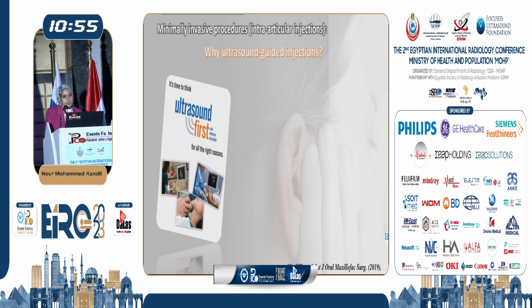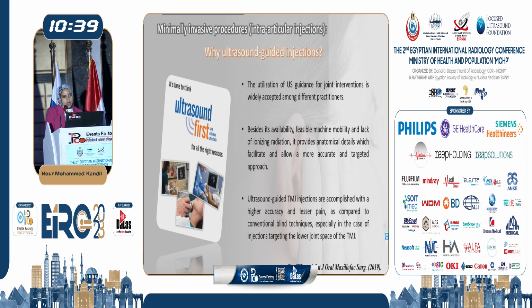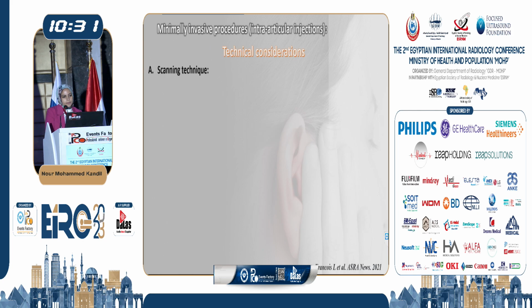Why ultrasound-guided injections? The utilization of ultrasound guidance for joint intervention is widely accepted among different practitioners. Besides its availability and lack of ionizing radiation, it provides anatomical details which facilitate and allow a more accurate and targeted approach. Ultrasound-guided temporomandibular injections are accomplished with higher accuracy and less pain as compared to conventional blind techniques.